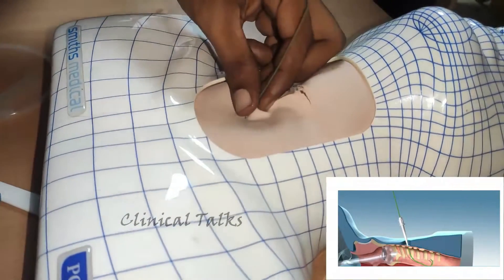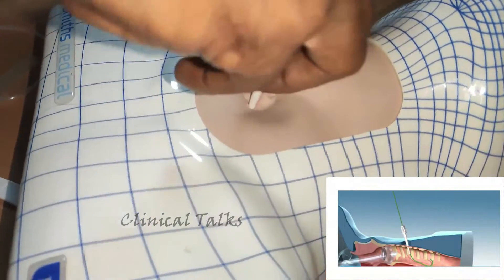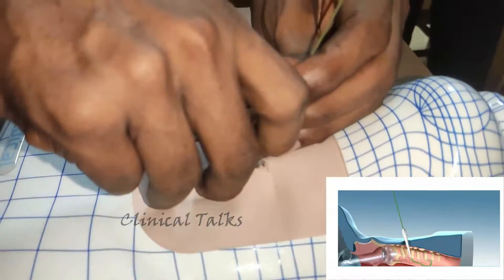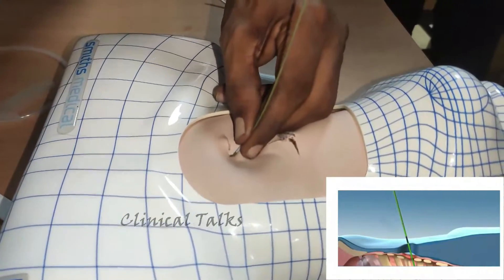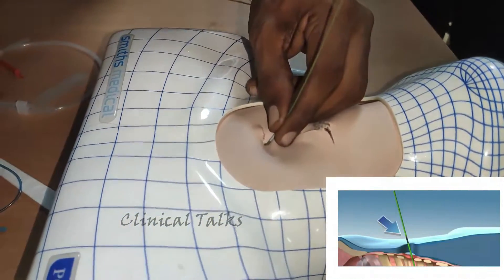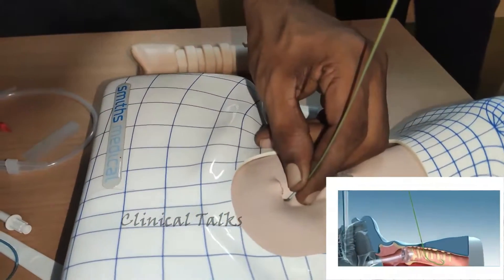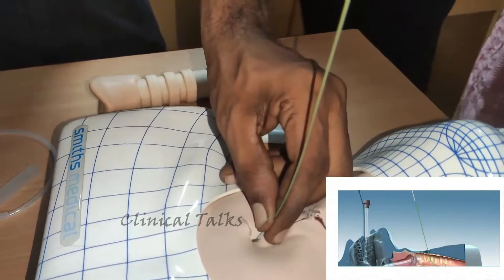Step 4. Advance the lubricated 14-gauge pre-dilator over the guide wire through the soft tissues until resistance is felt on the trachea wall. With a gentle twisting motion of the dilator, advance the dilator to penetrate the pre-tracheal tissue and anterior trachea wall. Remove the dilator, leaving the guide wire in place, ensuring that the first mark on the guide wire is at the skin level.